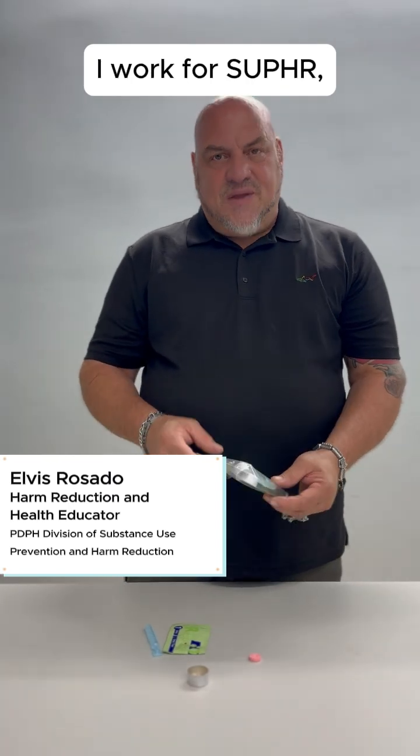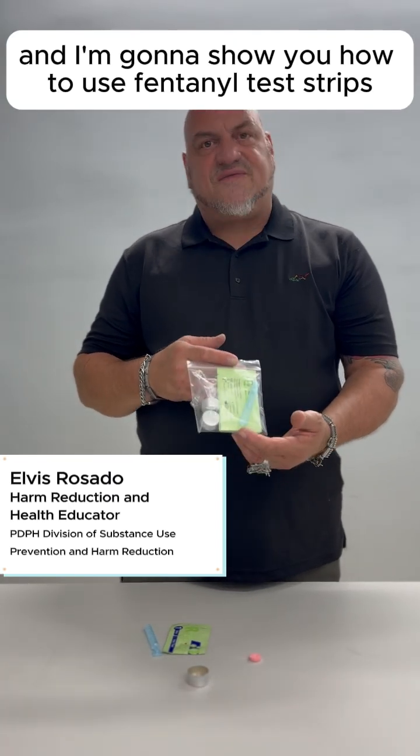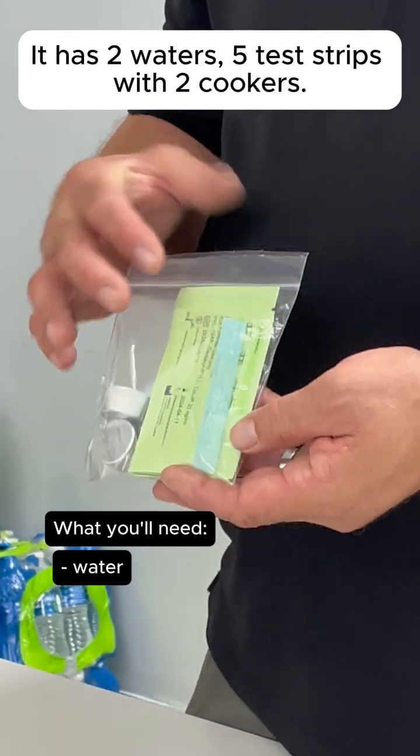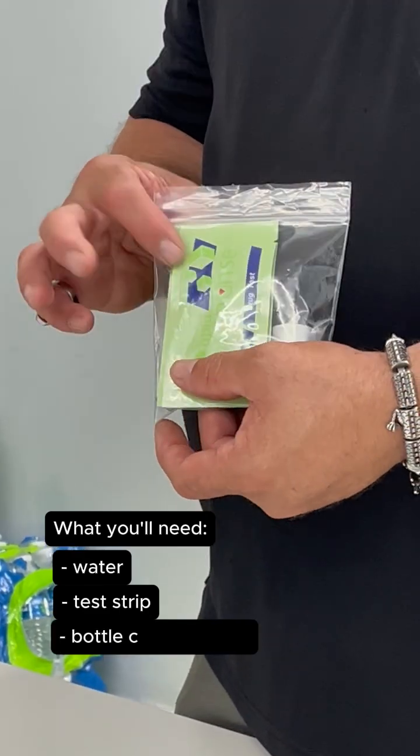Hi, my name is Elvis. I work for Super and I'm going to show you how to use fentanyl test strips today. Generally, we give out a kit that looks like this. It has two waters, five test strips with two cookers.